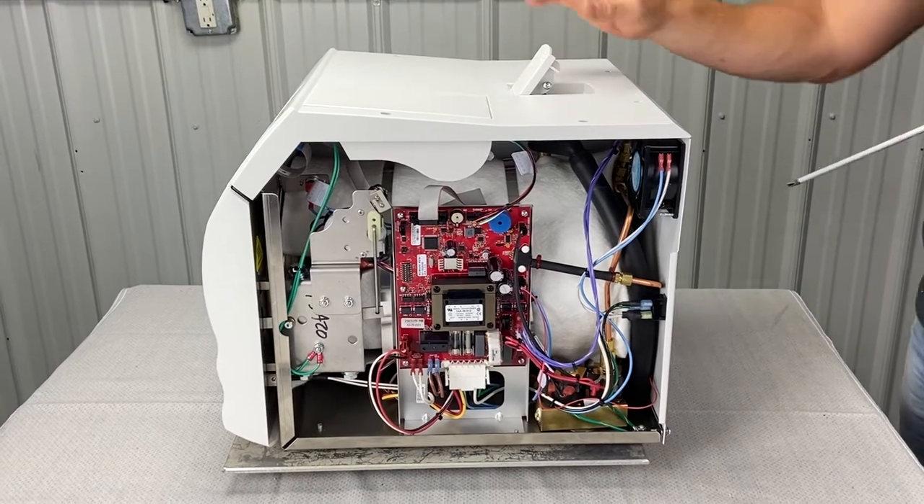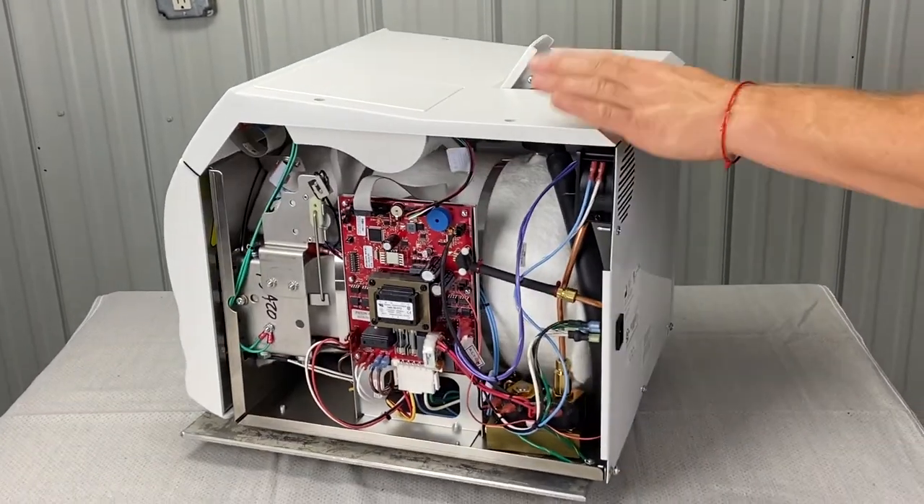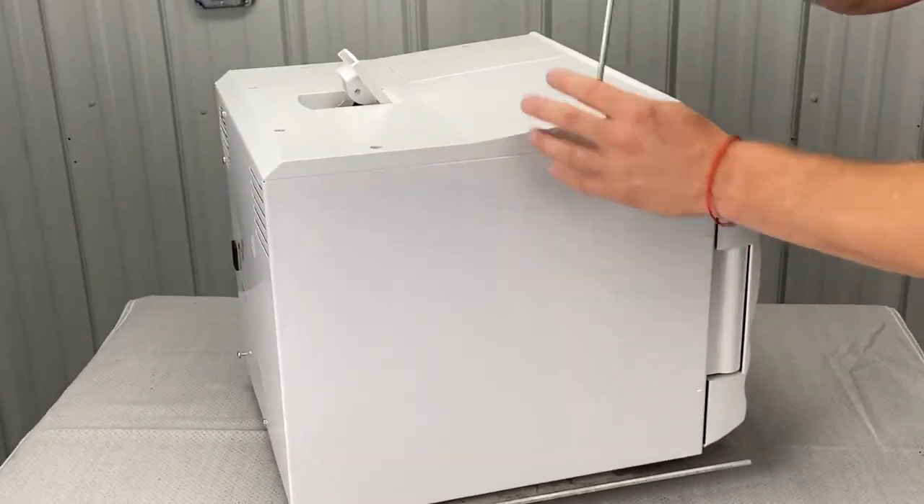There we go. Now the pressure relief valve is disconnected. So now we can take the top cover off. But first, I will go to this right side panel now.